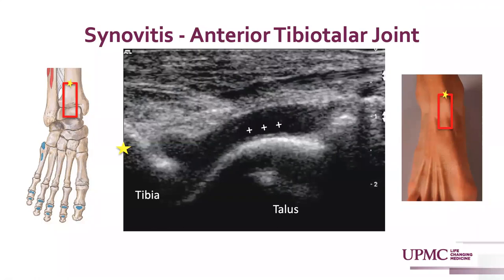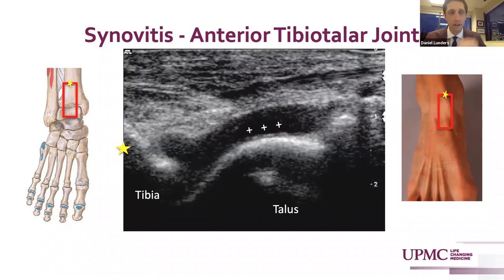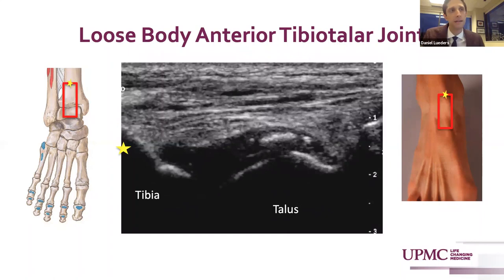Pathologically, a hypoechoic distension of the anterior capsule can represent an effusion or in this case a synovitis. Loose bodies can also be deposited in the anterior joint recess, indicated in this image with hyperechoic multifocal punctate structures, indicative of a cartilaginous or bony loose body.